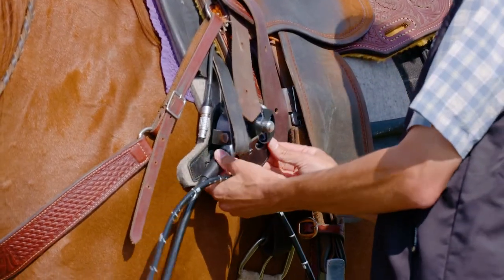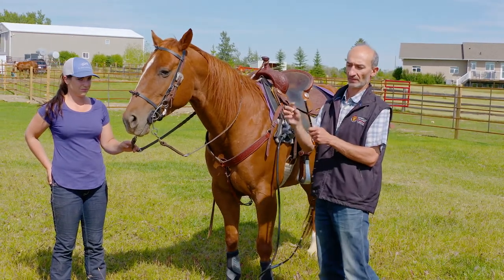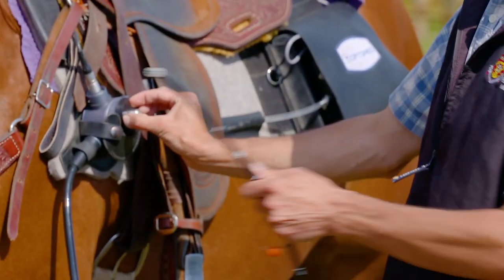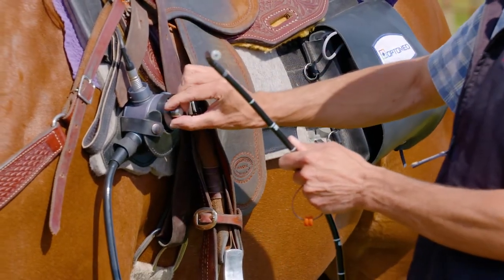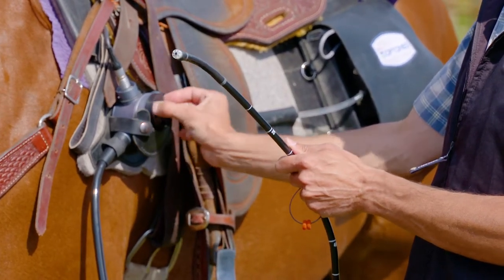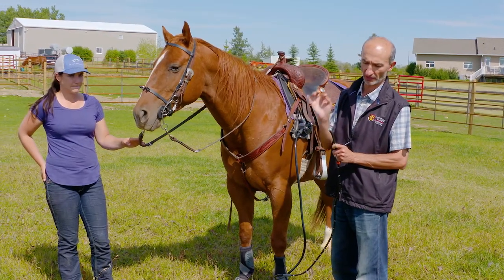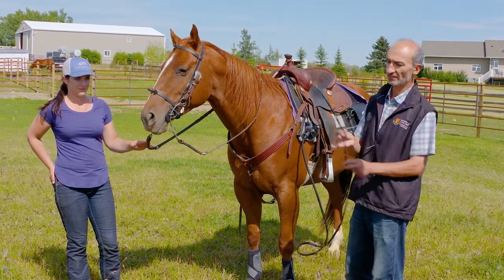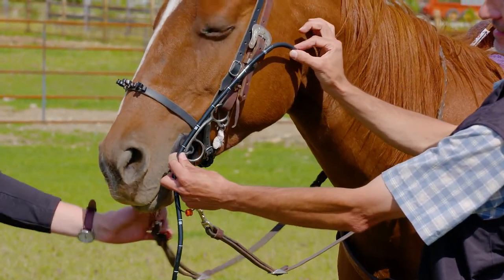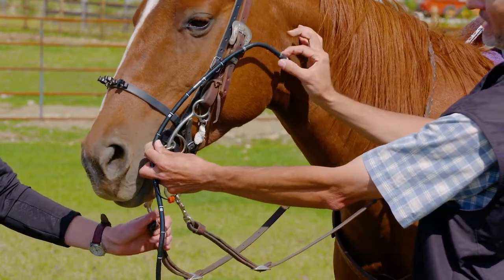The endoscope is attached to the horse, and that's the tip with the camera, so I can steer only one direction. If I turn the wheel down, it will bend the endoscope like that. We have some lights and we have the nozzle here to spray the water. And so this is going to go into the horse's head like this, and it is going to look down like that at the throat. And now we have to keep it in place like this.